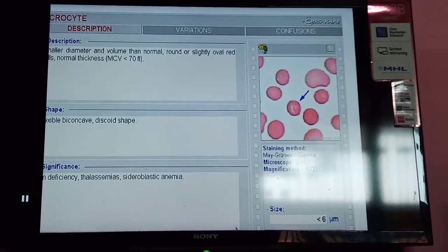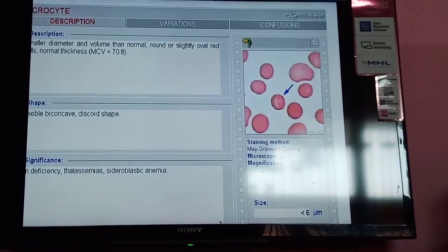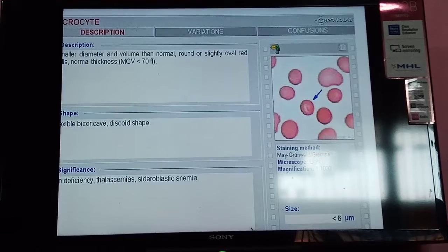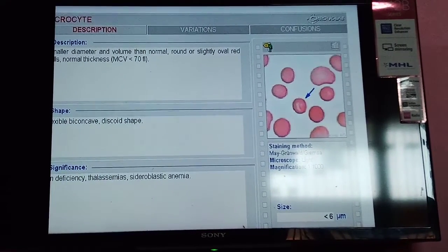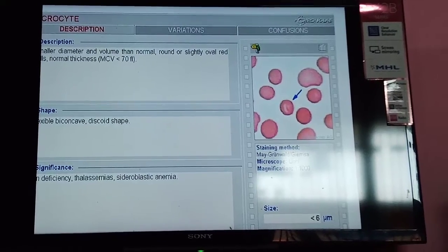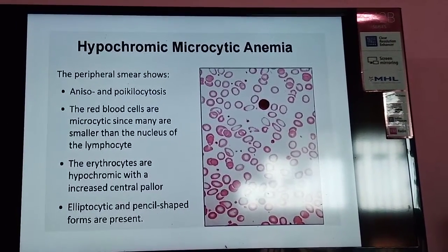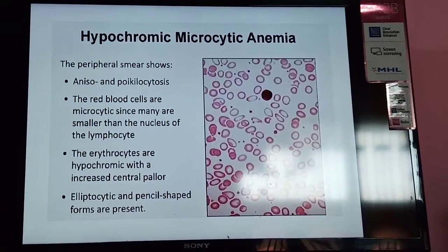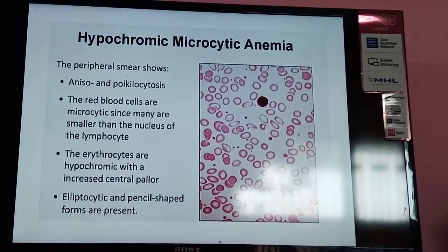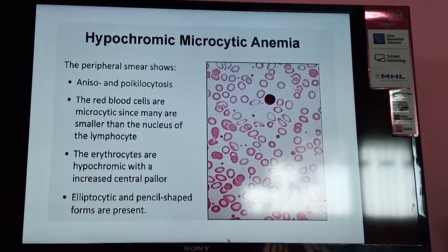In the diagram, arrows indicate microcytes, which have a smaller diameter and volume than normal RBCs and are slightly oval. MCV is usually less than 80 femtoliters, sometimes less than 70 femtoliters. The RBC shape is a flexible biconcave disc, seen in iron deficiency anemia, thalassemia, and sideroblastic anemia. In the peripheral blood smear, there is anisocytosis — a change in size of RBCs — and poikilocytosis — a change in shape of RBCs.